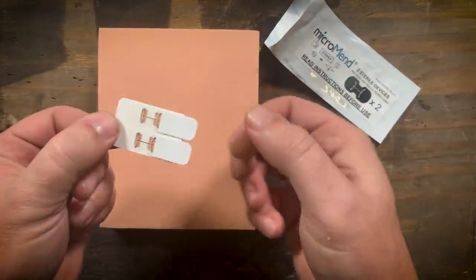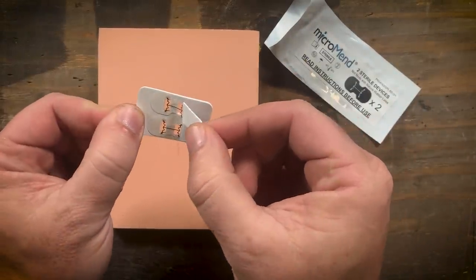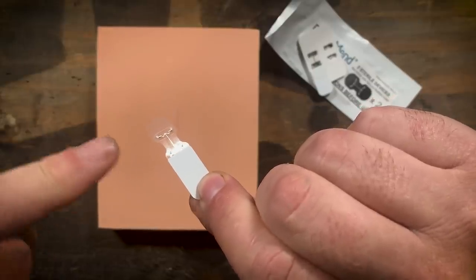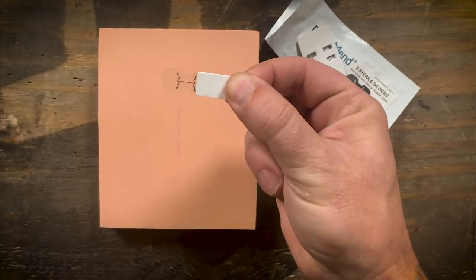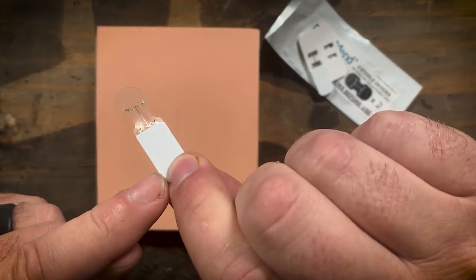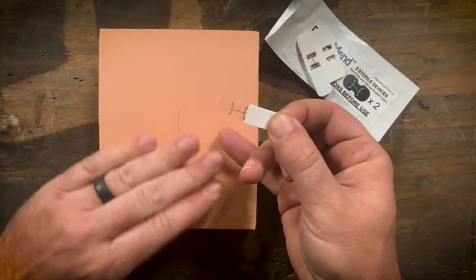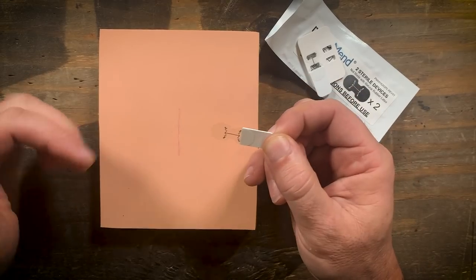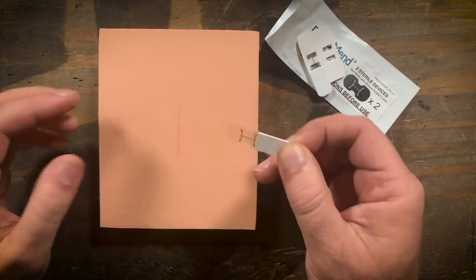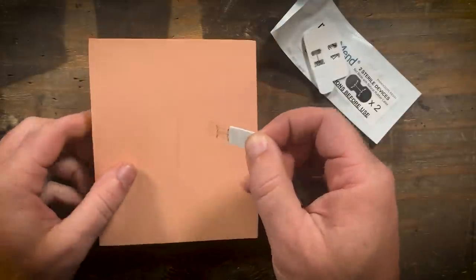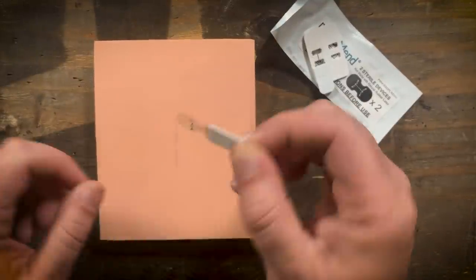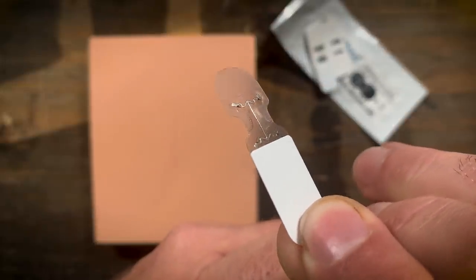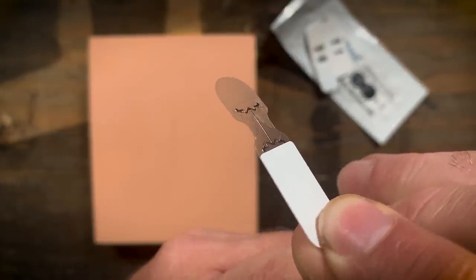What you want to do is peel one of these off. This is the sticky side. You don't want to touch this, obviously only use one hand and hold it with the tab. It's recommended that the area is dry so you want to get the bleeding under control, get it clean and let it dry so that you get the best adhesion possible with this right here.